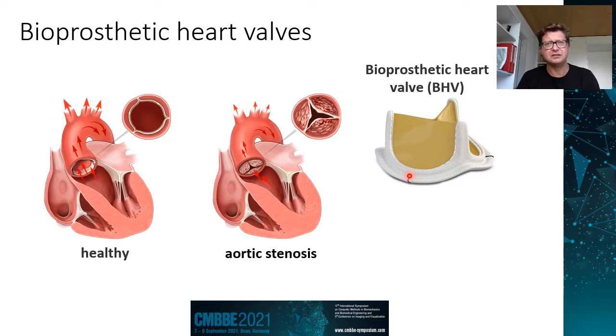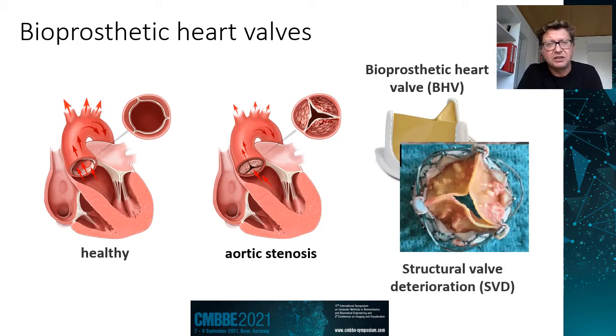However, they tend to recalcify and obstruct the blood flow again after maybe 15 years or 20 years in a process called structural valve deterioration, SVD. Now, there are many causes for this SVD. One of them is believed to be leaflet fluttering.